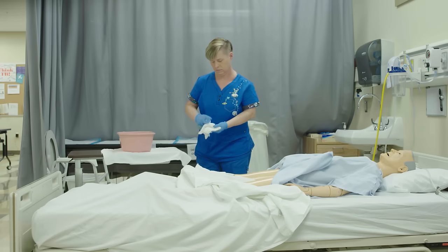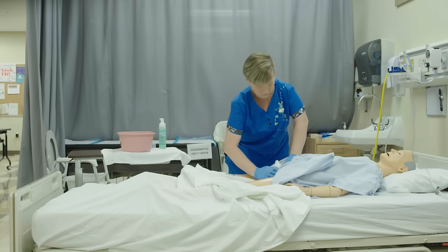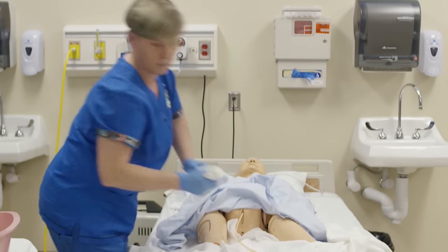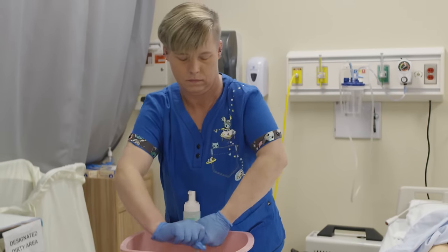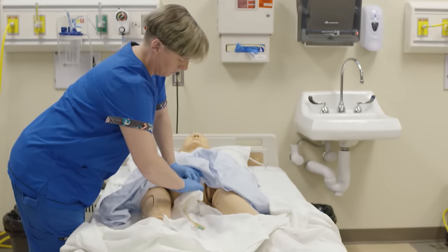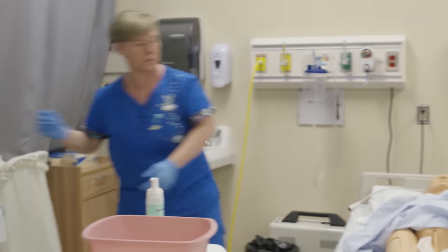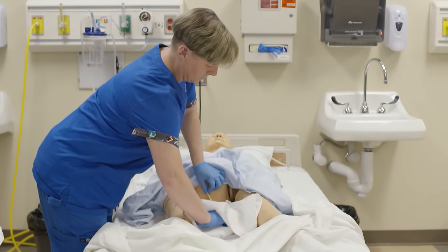A critical step, while holding the catheter at the meatus, without tugging, the candidate cleans at least 4 inches of the catheter from the meatus, moving in only one direction, away from the meatus, using a clean area of the cloth for each stroke. Another critical step, while holding the catheter at the meatus without tugging, rinses at least 4 inches of catheter from meatus, moving only in one direction, away from meatus, using a clean area of the cloth for each stroke. While holding the catheter at the meatus, without tugging, dries at least 4 inches of catheter, moving away from the meatus.